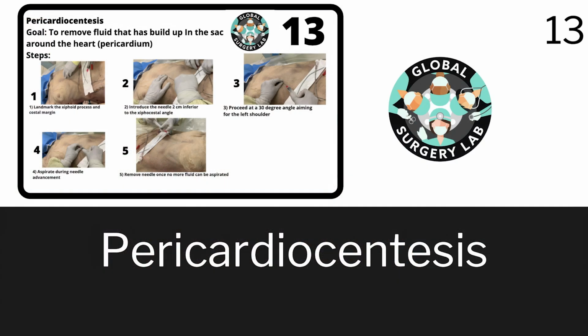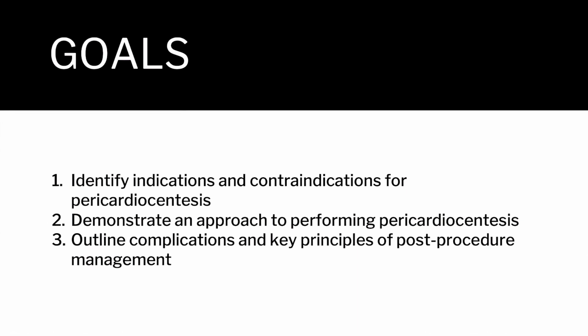The Global Surgery Lab presents the pericardiocentesis procedure. The goals of this video are to identify indications and contraindications for pericardiocentesis, to demonstrate an approach to performing pericardiocentesis, and to outline complications and key principles of post-procedure management.